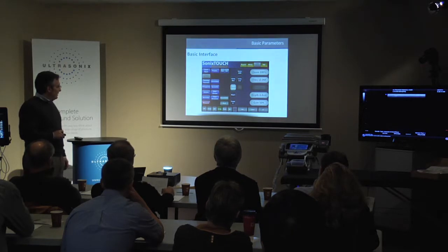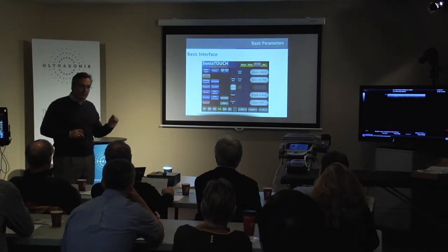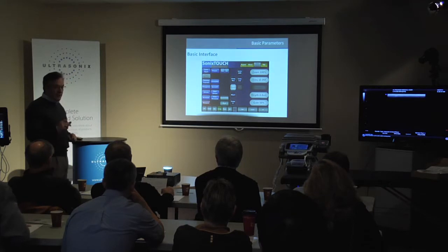And gain, the gain function on this button adjusts the gain on the overall image. Sometimes when you want to enhance the gain in the far field, there's another area called TGC, time gain curve, that enlists the individual segmental enhancement of the signal amplification individually in any aspect of that field. And I'll go into that as well.